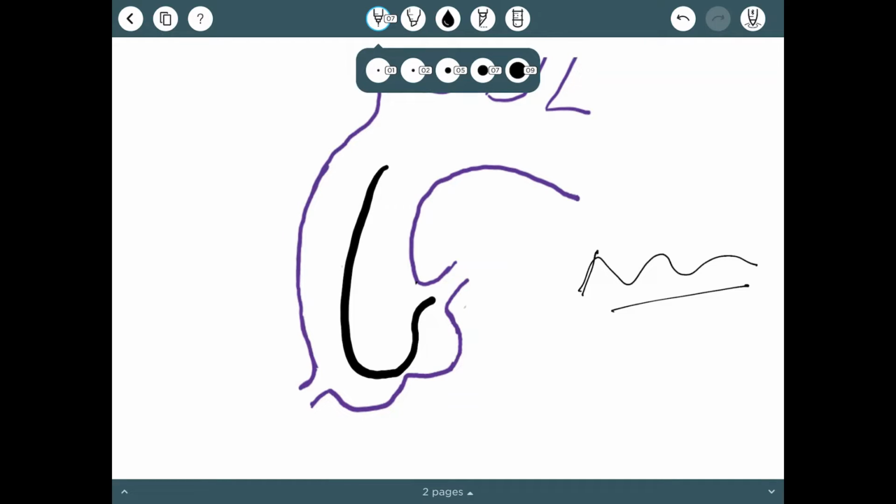It is made so that the secondary curve rests on the non-coronary cusp of the aortic root, and this shape gives it good passive support. We'll discuss what passive support and active support are. The unique advantage of AL catheters, particularly AL1, is that they can be used to intubate multiple anatomies, whether corresponding to the right coronary or the left coronary artery.